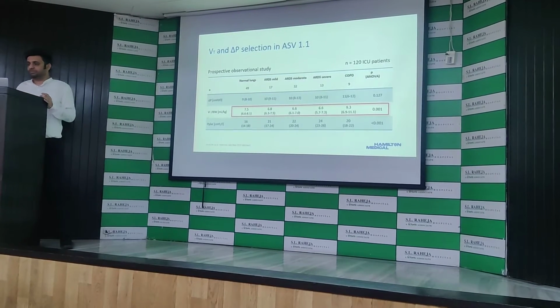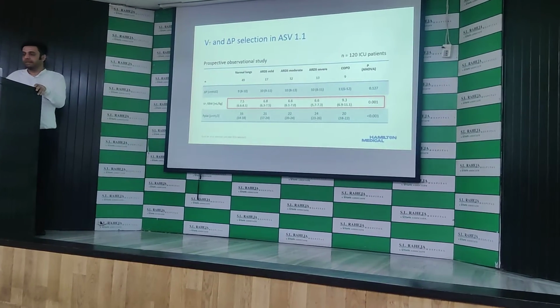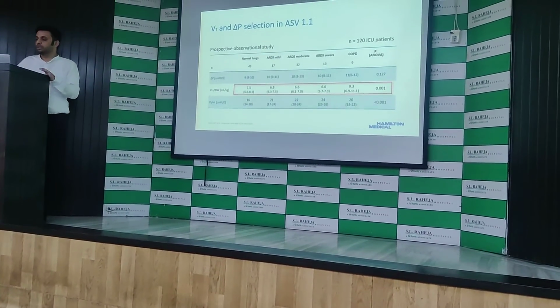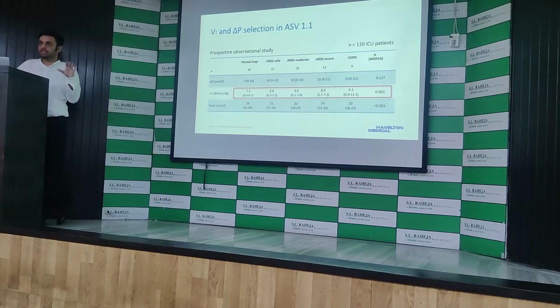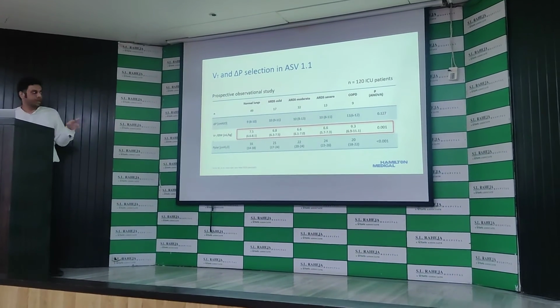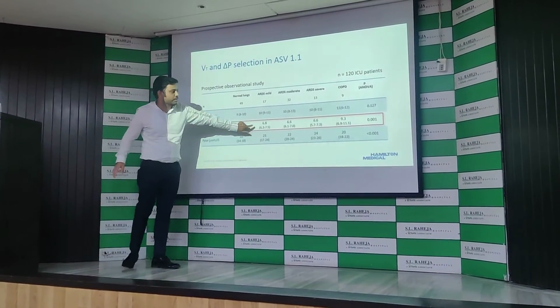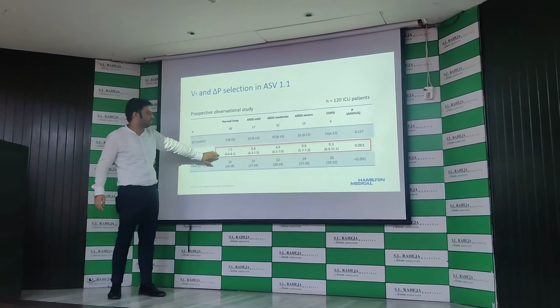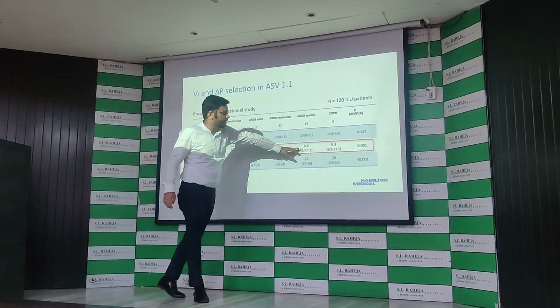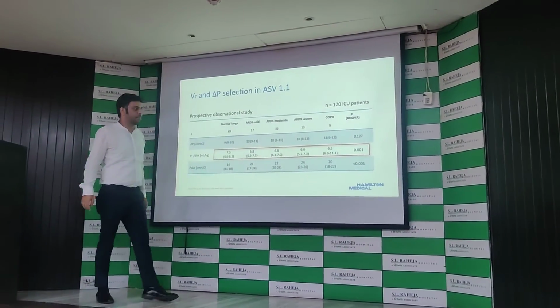Moreover, ventilator-induced lung injury can be prevented by limiting the driving pressures and the tidal volumes. So the ASV algorithm determines, for a given minute volume, the respiratory rate and the volume combination associated with the minimum work of breathing. So if you see here the plateau and the change in the pressure, and these are the volumes which have been achieved: for the normal lungs 7.5 ml per kg, for the ARDS mild, moderate, and severe it can be achieved as low as 6.6, and moreover for COPD it can be achieved at a higher range also.